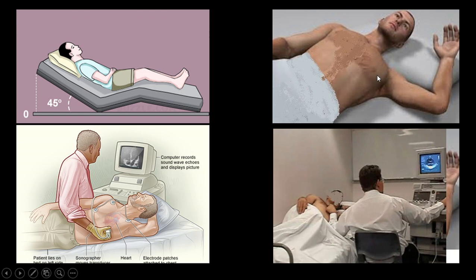Even in the classic position, maybe we need to turn the patient during the scan, turn more to the left lateral, or a little more flat. It depends on how we get the image, and you have to be very flexible with the position of the patient, and keep in mind that it affects the quality of your image and finding good windows a lot.